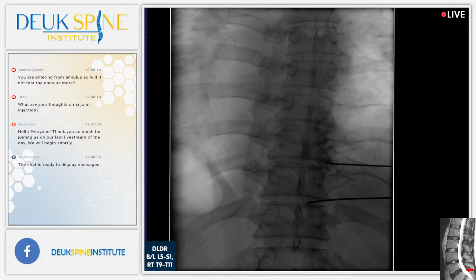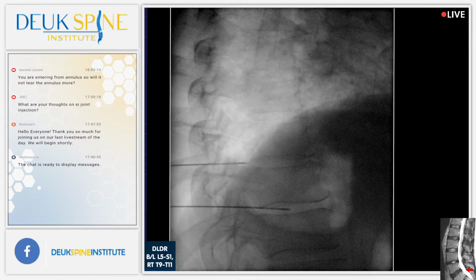God, it looks perfect. Yeah. Looks good. Lung fields look good. I don't see any pneumothorax, so it's good. He's stable, right? Yeah. No, we're pretty much there, so I will need him awake. Shot?